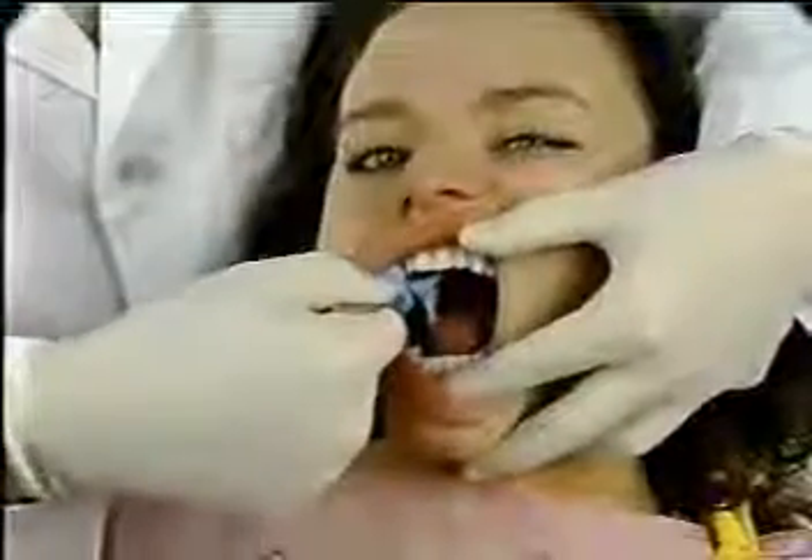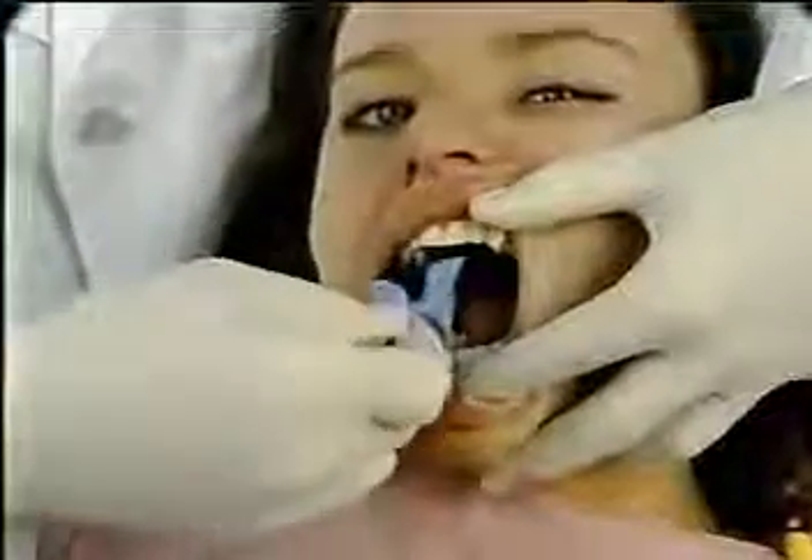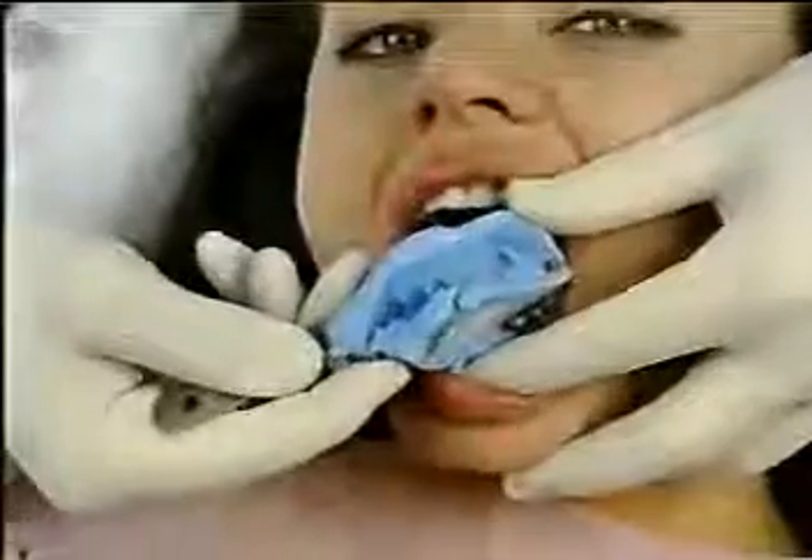Making an accurate impression the first time is expected if all the margins are clean, dry, and exposed. Notice the clean, highly detailed margins that are possible to achieve using this technique. Some dentists choose to pack a cord prior to subgingival tooth preparation. Ultra-pak knitted cord will not entangle in diamond burrs during cutting with high speeds, and packing prior to subgingival margin extension helps protect gingival attachment.